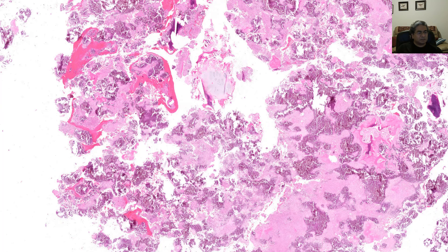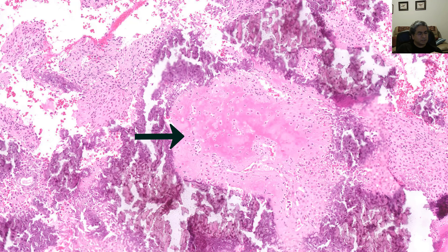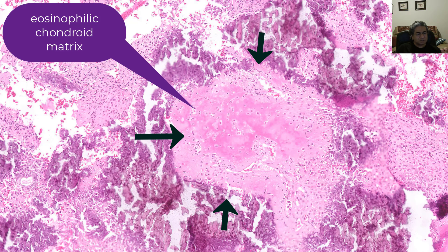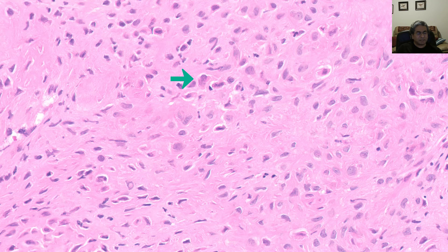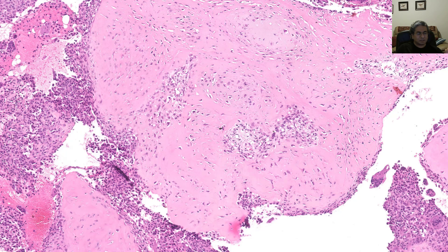Those cells are what you need to make a diagnosis of chondroblastoma. But there are all kinds of variations on that theme. Some tumors can be very heavily calcified. Additionally, you may see an eosinophilic chondroid-like matrix, and within that matrix the cells may be spindling out a bit. But if you look hard enough, you will find those classic cells of a chondroblastoma.